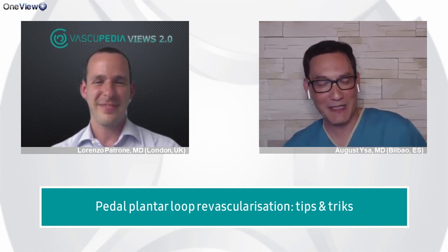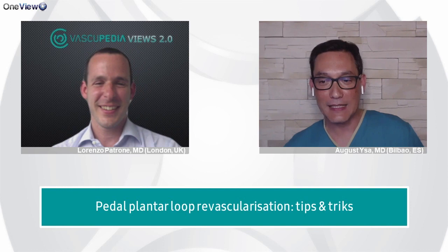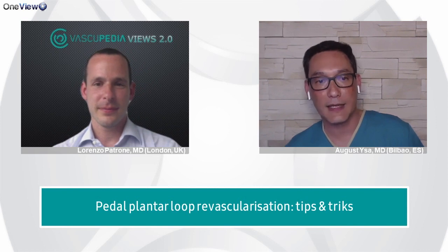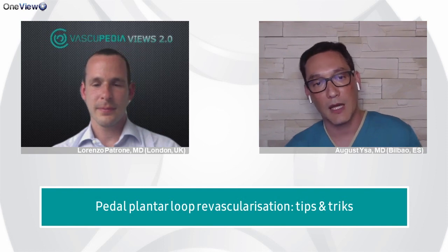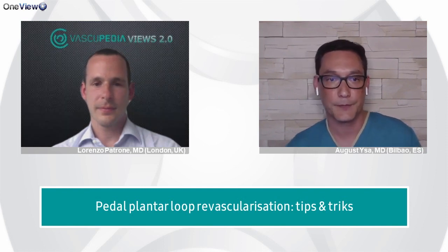Well, I would say that this is nice, this is fancy, this is elegant, but be cautious. You definitely need to master these techniques, because otherwise your success rate for BDA cases will be really low, and more than 20% of the cases cannot be performed without all of these extreme bailout maneuvers.